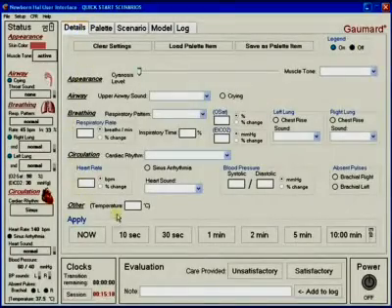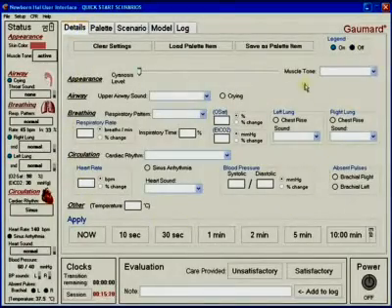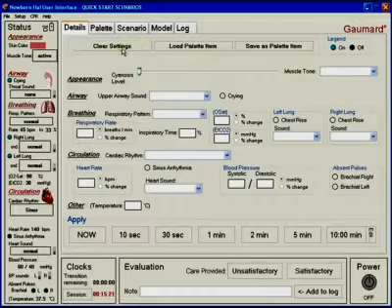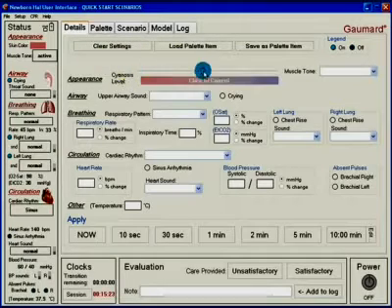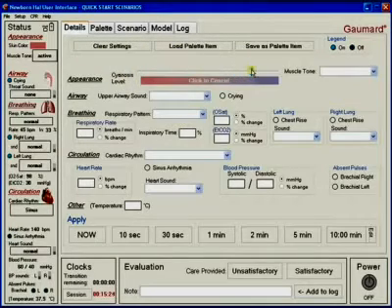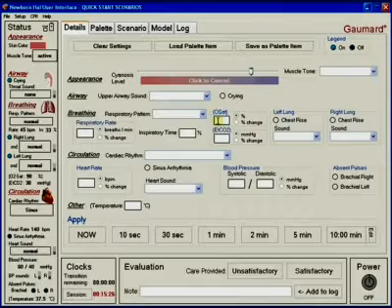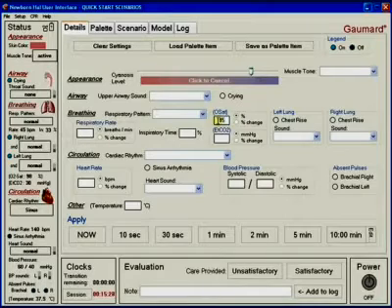The details tab is the first one presented to the user after starting up the software. From this area, users can change the parameters associated with newborn HAL's physiological state.